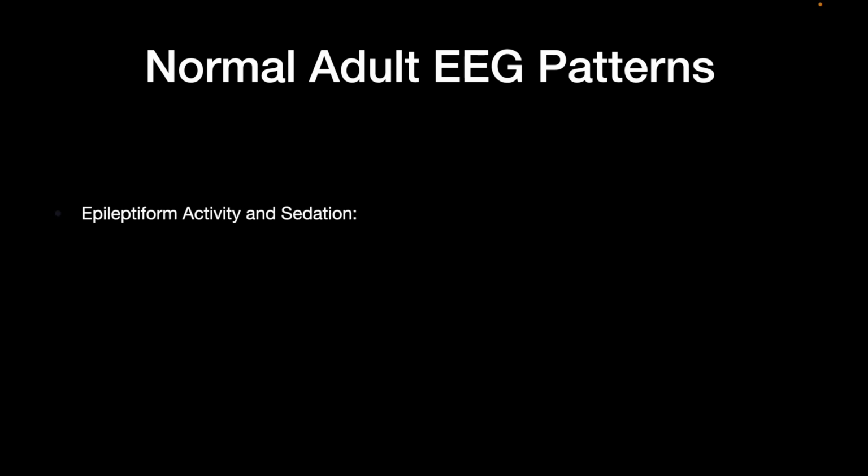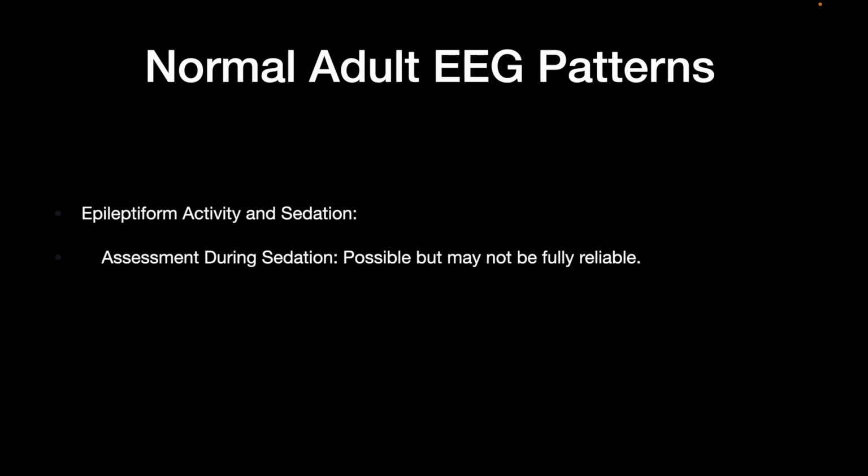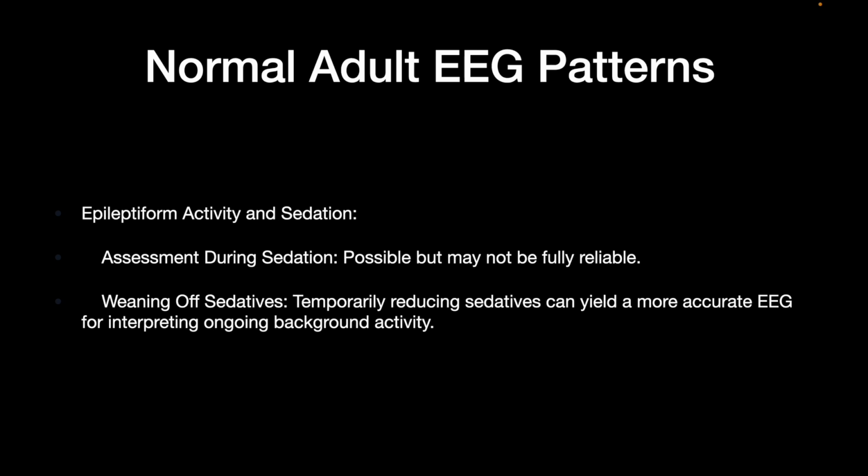Now, epileptiform patterns and sedation. The assessment during sedation is possible but may not be fully reliable because the sedative agents can reduce the epileptiform activities. Now, weaning from sedatives, or temporarily reducing the sedative requirement, may yield a more accurate EEG for interpreting ongoing background activity.